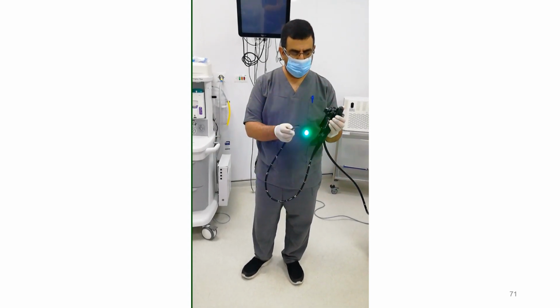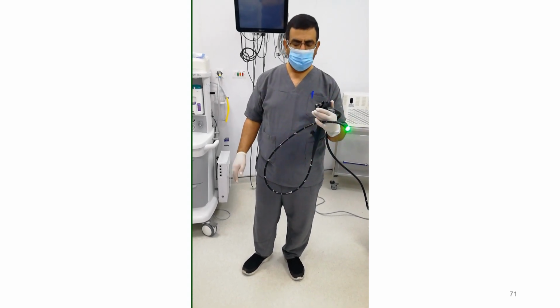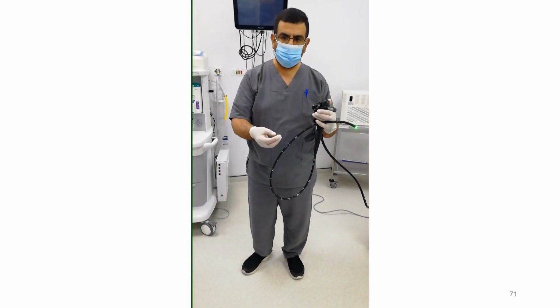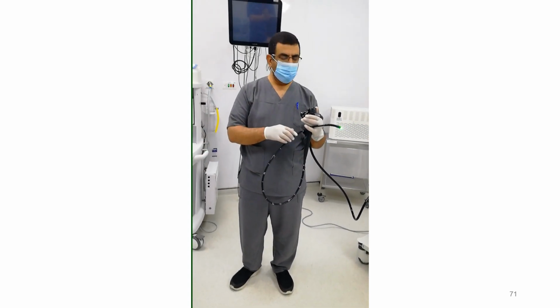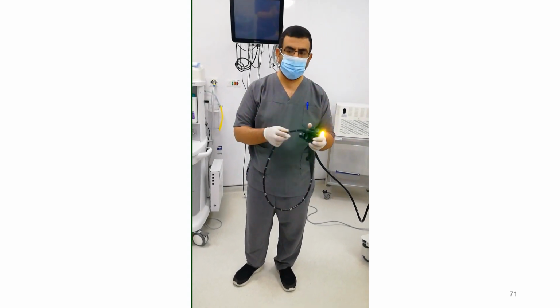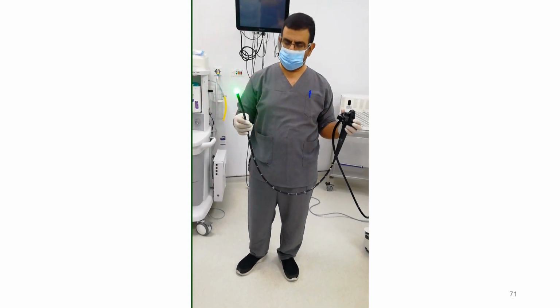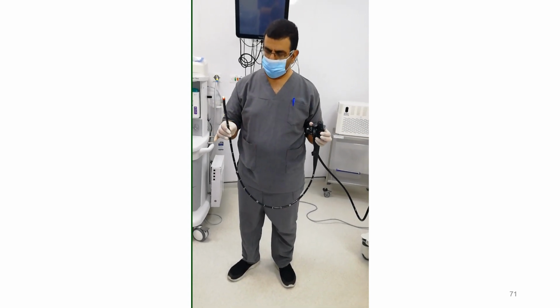وأنا شغال بإيدي كده بجيب المنظار ما بين الصباعين وأروح متكي كده عليه وأنا شغال، يبقى أنا عملت له فيكسيشن بالفنجرز بتاعي، فحركة المنظار بتقل وده بيساعدك في فك اللوبس. واللوبس يا جماعة بتتكون في المعدة لو المعدة كبيرة أو فيها أوبستراكشن أو إذا كانت جي شيب ستوماك. خلاص كده اتفقنا؟ يبقى إحنا كده عرفنا حركة جديدة اسمها حركة الفيكسيشن. زي الفيكسيشن دي برضه بتتعمل في منظار القولون، بعض الناس بتشتغل وبيعمل فيكسيشن للمنظار بتاعه عن طريق الفخذ.